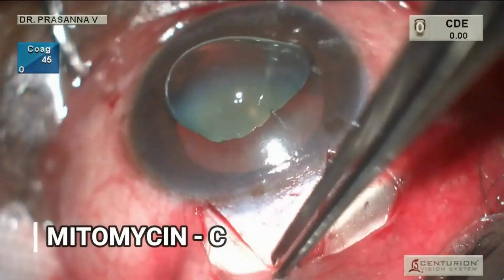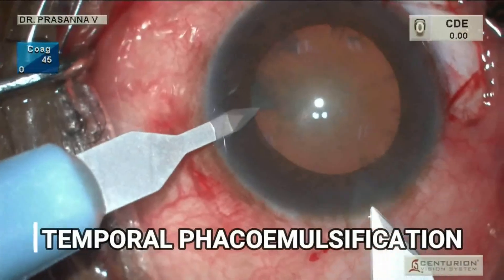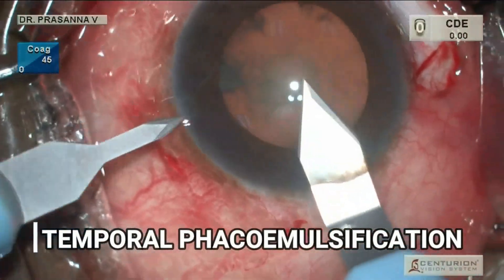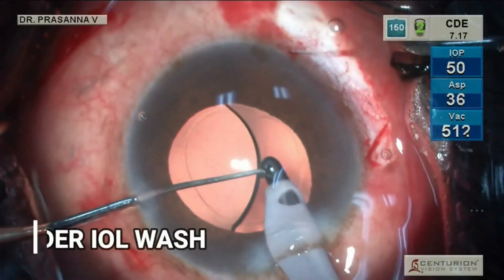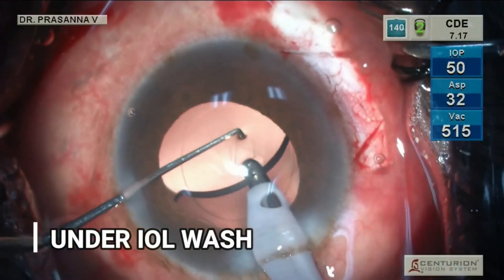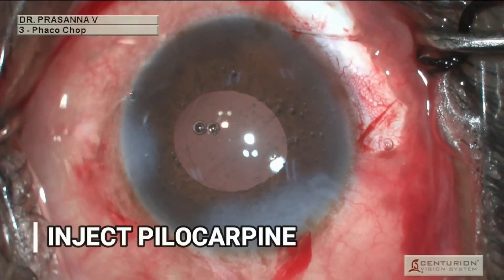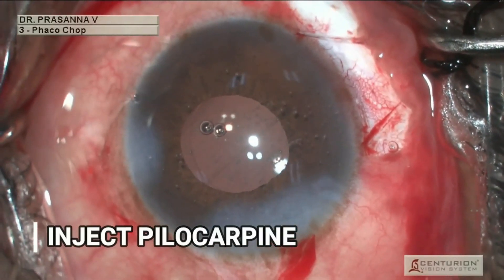After MMC application, temporal phaco is completed. The pupil is constricted and the main wound sutured.